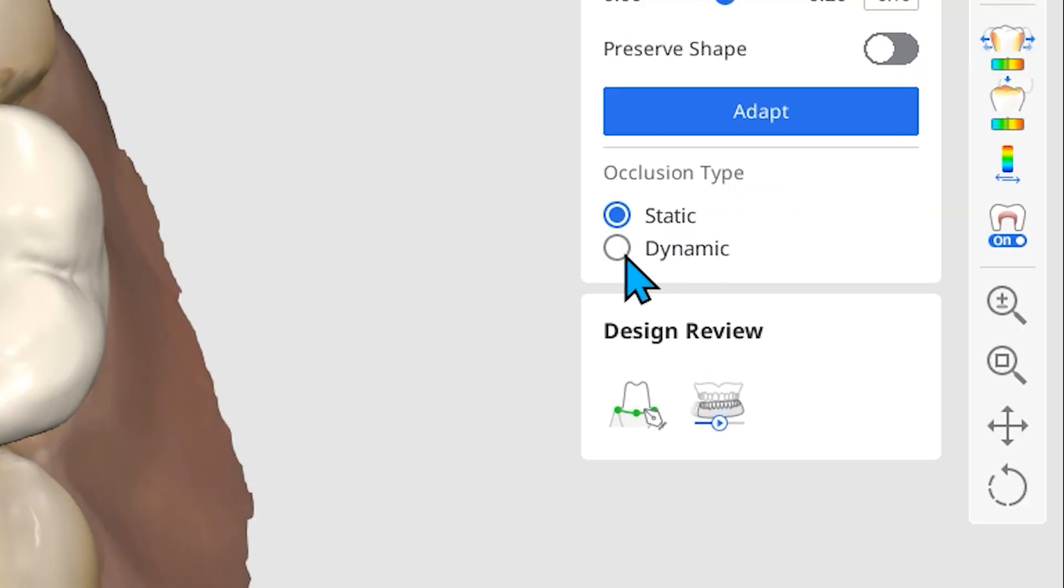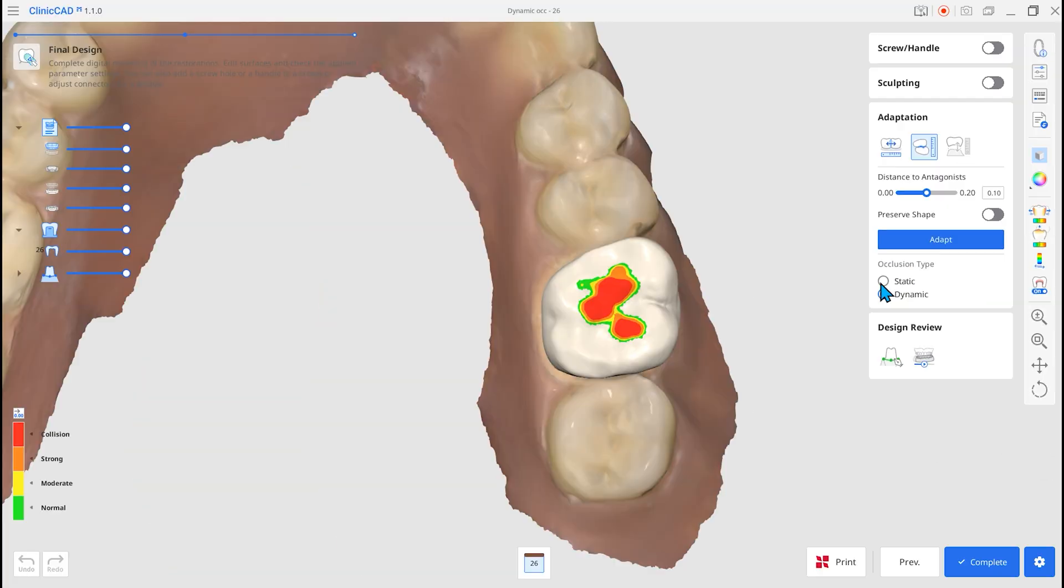Set Occlusion Type to Dynamic and click Adapt to remove occlusal interferences from the restoration during mandibular movement.